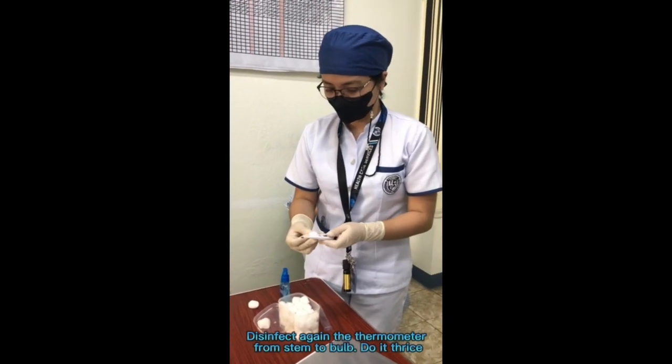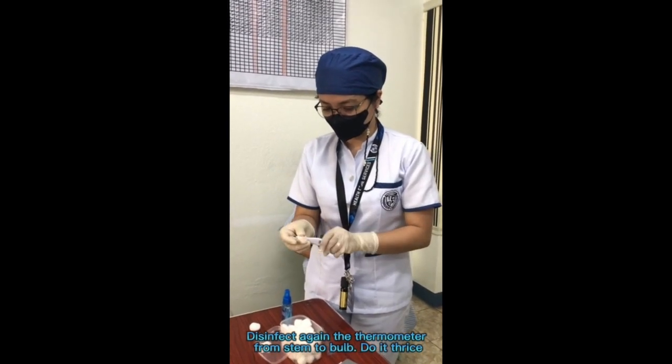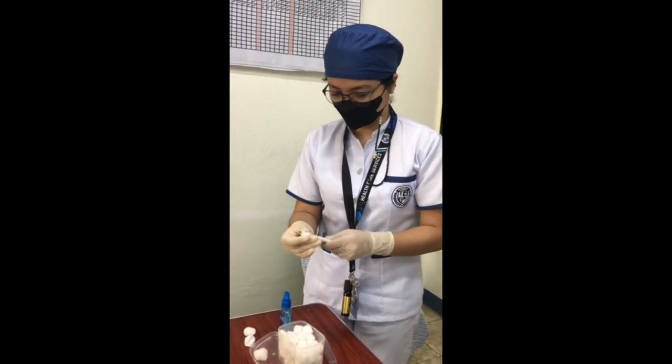Disinfect the thermometer again from stem to bulb — this is the process in reverse from the first disinfection — starting from the cleanest side, the base where the thermometer starts to narrow, to the dirtiest side, the silver tip of the thermometer. Make sure to do it thrice.